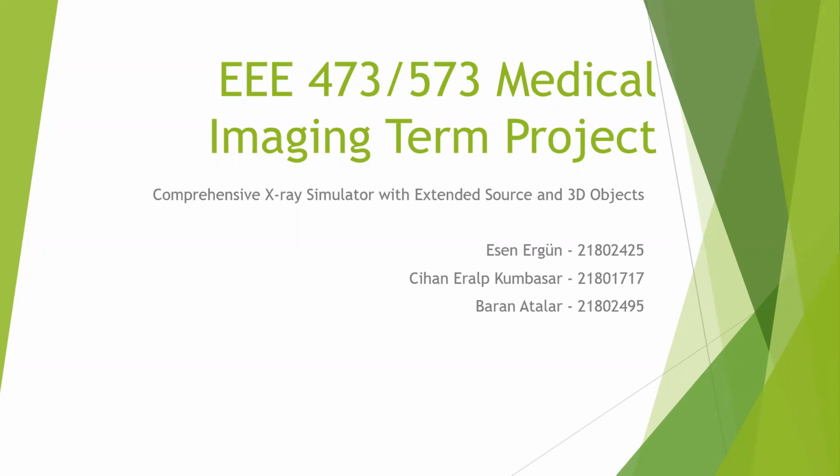Hello, today we will be presenting you our medical imaging term project. We have worked on building a comprehensive X-ray simulator with extended source and 3D objects.